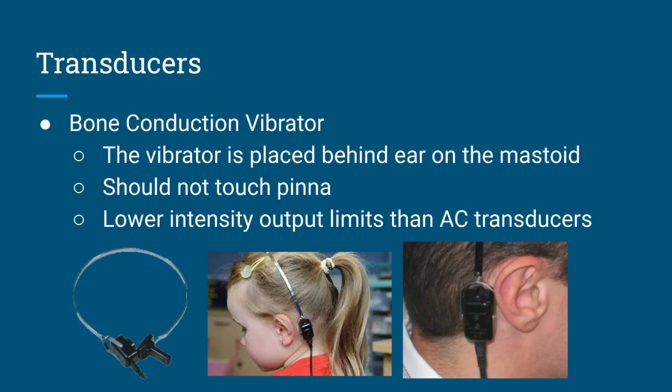So air conduction masking is needed to deliver to the non-test ear so that ear-specific results can be obtained from the test ear. Testing is from 250 to 4,000 hertz. Output limits are frequency specific, but usually limited to about 75 to 85 dBHL at their max.